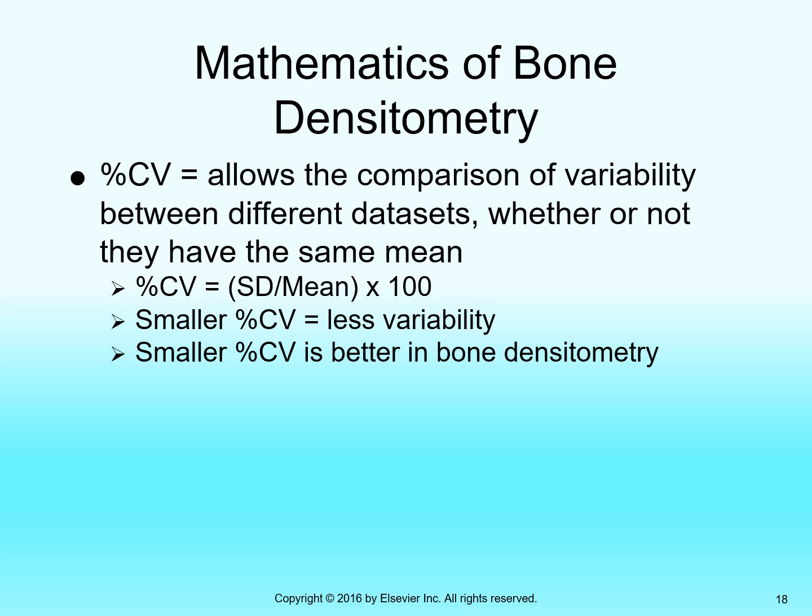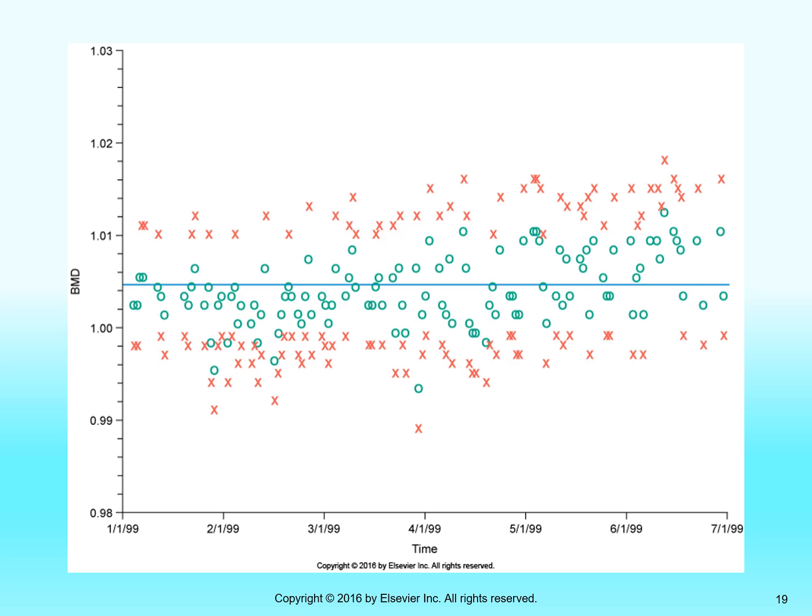And that's how you can tell the difference between a GE and a Phillips: one of them is going to have a smaller percent CV. If one has a smaller percent CV, then those measurement numbers are more believable than the other measurement numbers. If the percent CVs are the same, then both numbers are believable. See how that goes? All right, so this is an example.